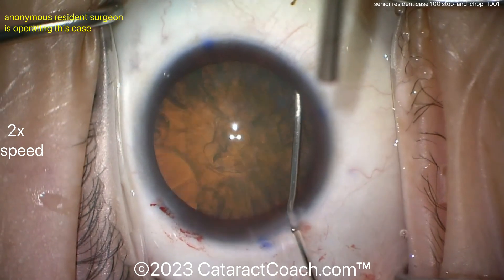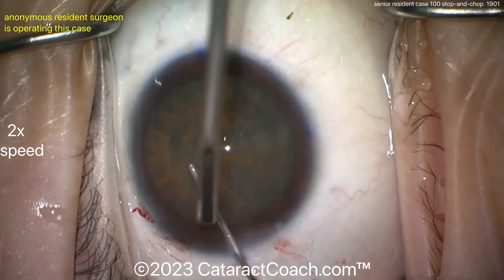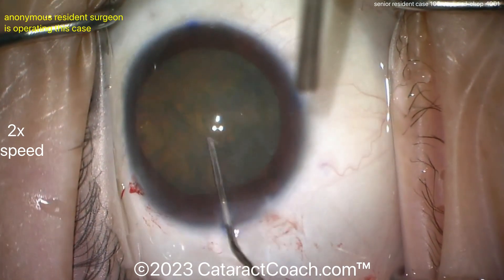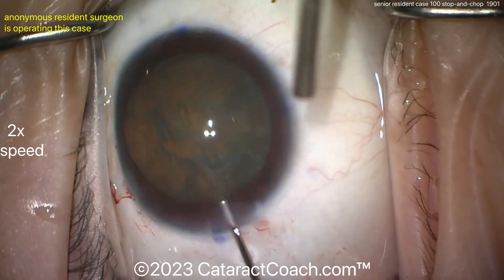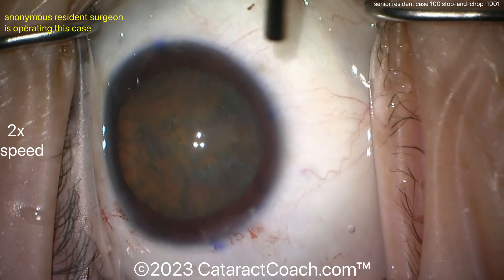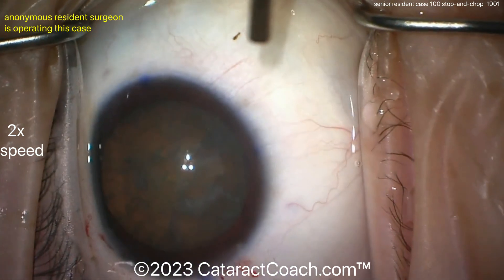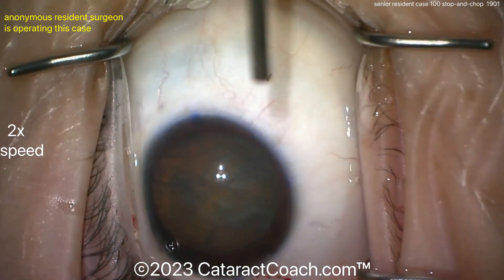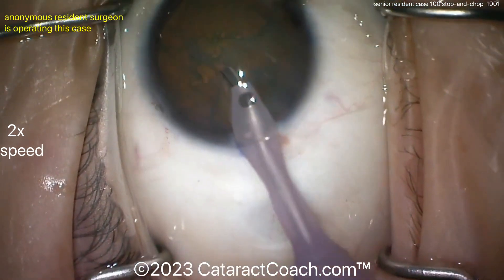Releasing some viscoelastic, and there's the hydrodissection. Let's see tapping down the nucleus — a little more hydrodissection. The attending's cannula is right in the middle of our view; can he or she retract that a little? It's a bit overbearing. Now you can see the incision does look short — it's a little on the short side. It'll seal up fine, hopefully; if not, you can put a suture in.